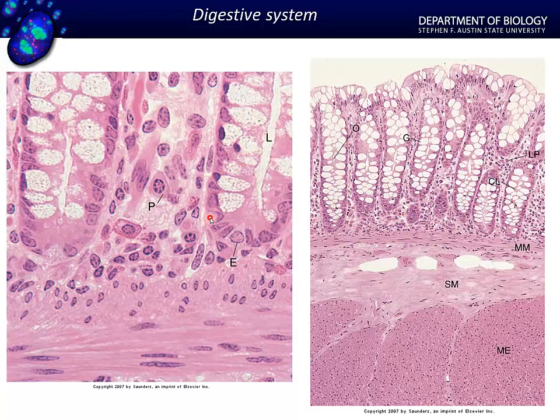And in looking at a higher mag, we can see again goblet cells, absorptive cells, regenerative cells. Here's an enteroendocrine cell. And you may look at that and think, oh, well, there's a Paneth cell. Well, look where it's located. It's not within the gland. It's in the lamina propria. That's actually an eosinophil. Now, as we look at other cells, here is one of our classic ones. We learned this very early in our connective tissue. But notice how we have the dot in the very center, the material on either side.